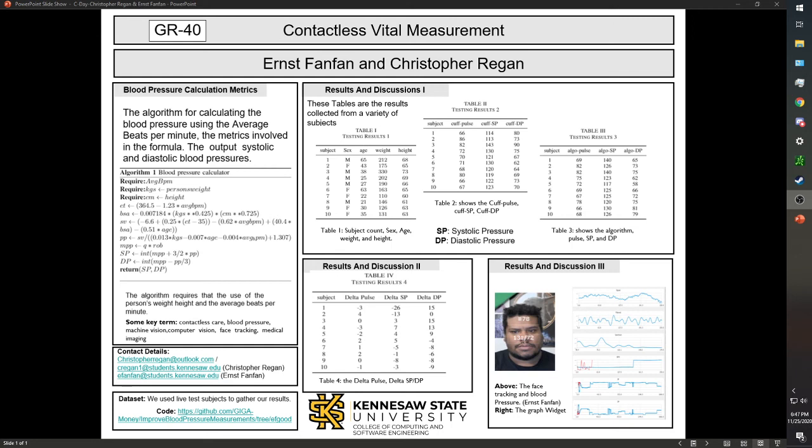As well, if you're a traveling medical professional who has to go to austere locations, for example the islands of Okinawa, to bring all this equipment you have to go on a small boat. Imagine just having a handheld device, and that's a lot less to pack to be able to do the same amount of work.